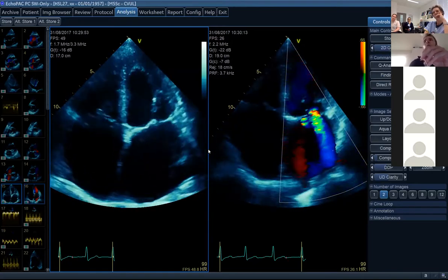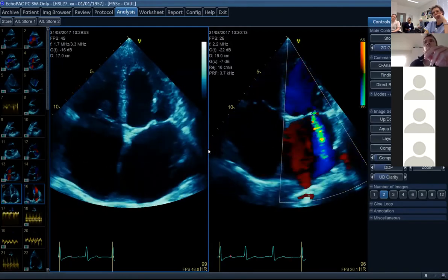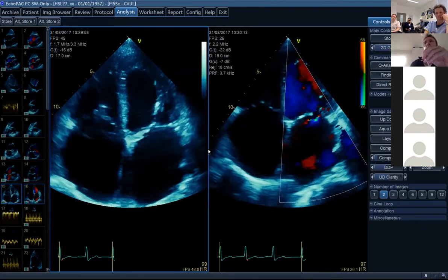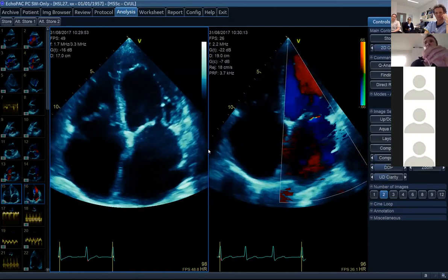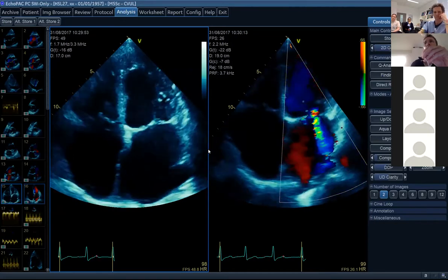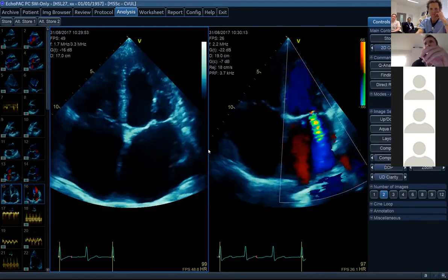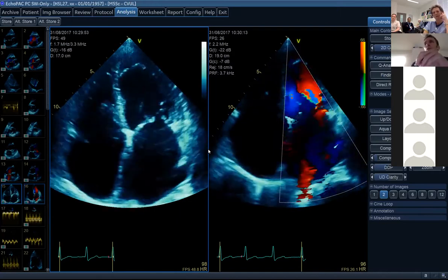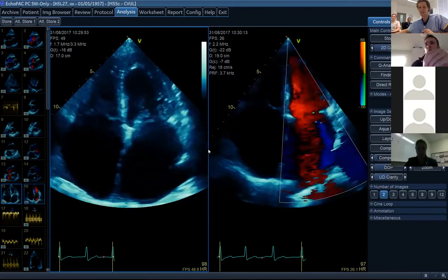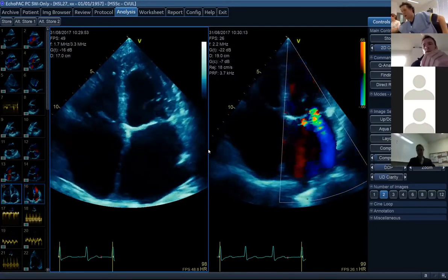There is mitral regurgitation. In that scenario, that always makes me very worried. I would say it's at least moderate. The jet is almost going along the wall a little bit. Is it maybe even going into the pulmonary vein there? Is there a possibility that it's severe? I would also be interested in what her loading conditions are, what she's otherwise like. Is she still hypotensive, or has she become hypertensive? She's not hypotensive any longer.